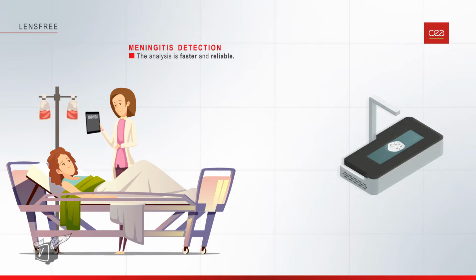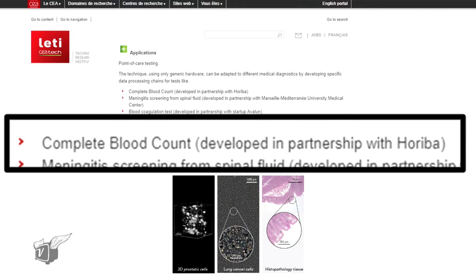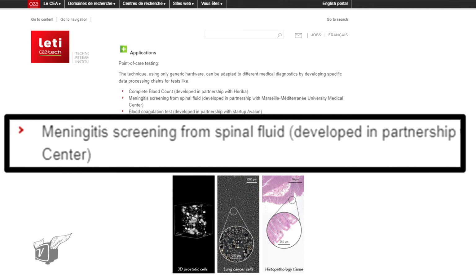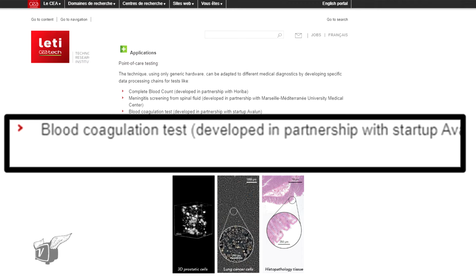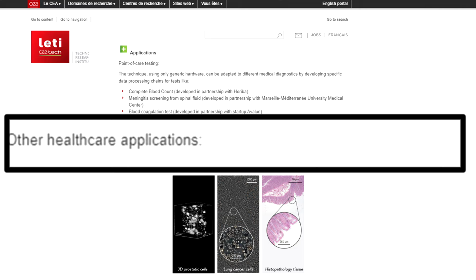And if we consider cerebrospinal fluid, we can count the number of white blood cells, and so we can detect if there is a risk of meningitis or not. That's huge, because now suddenly you don't have to have that delay of going to a lab and so forth. You can immediately diagnose something like meningitis, right? Yes, it can be done directly at the bedside.